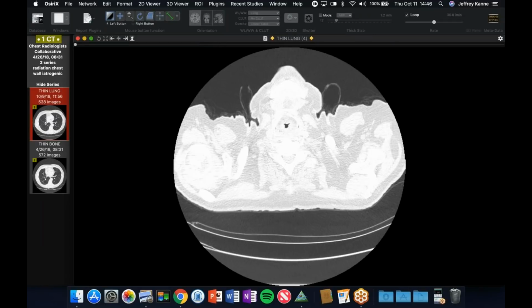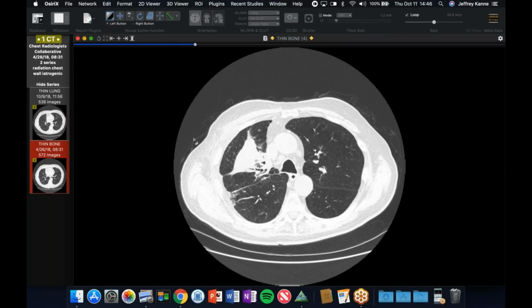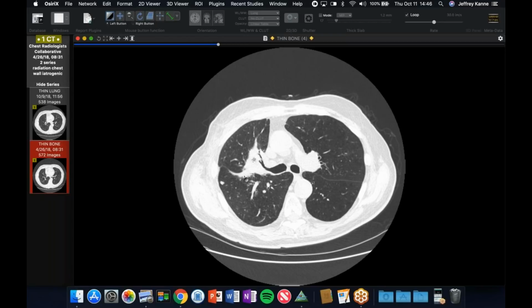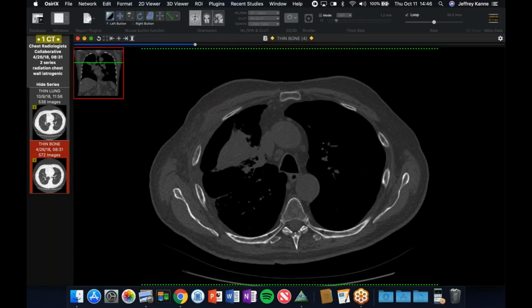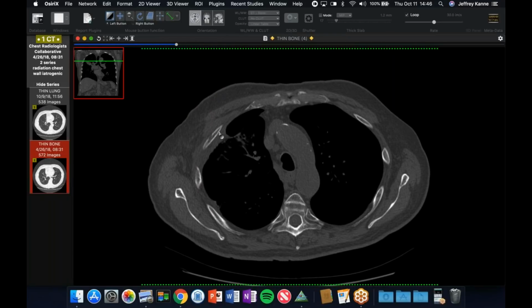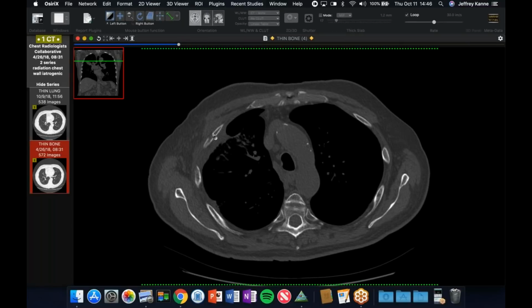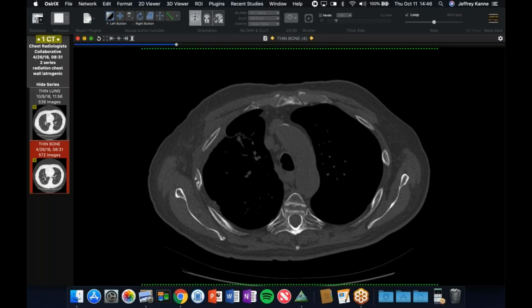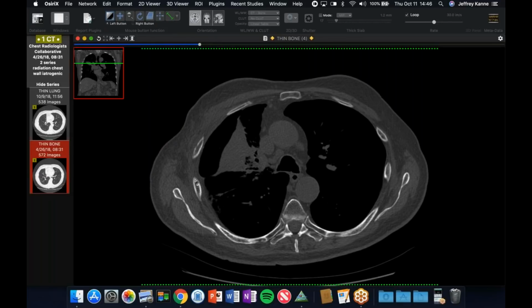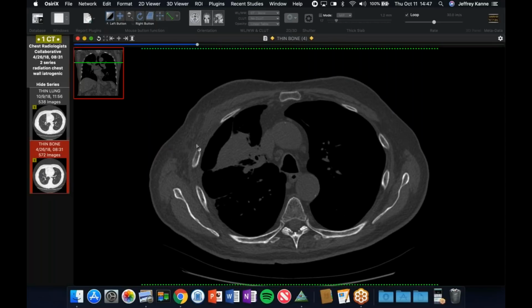This patient had a lung cancer. And so if we go back to April, you can see there was this mass in the right upper lobe that had been radiated. And at that time, you can see there's some soft tissue thickening in the extrapleural area, and also maybe a little bit on the outside of the ribs. And there's this little lucent area in there. And so, of course, you could think about a metastasis, but this is right in the treatment field. And there's the same thing going on with the rib above it, and even right down there as well. So it looks more like radiation because it's involving a couple ribs right in the same area.